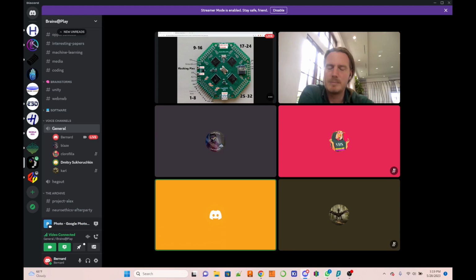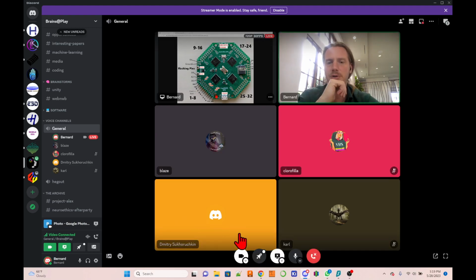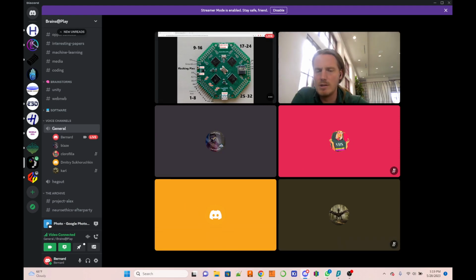Yes, and also between boards. Yeah, and between boards, if you connect that pin, which is here. Great.